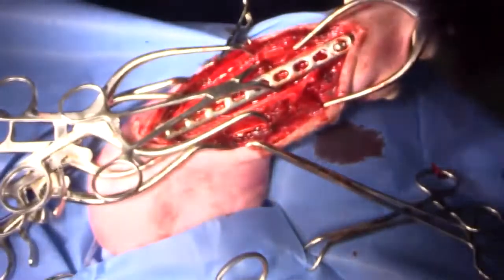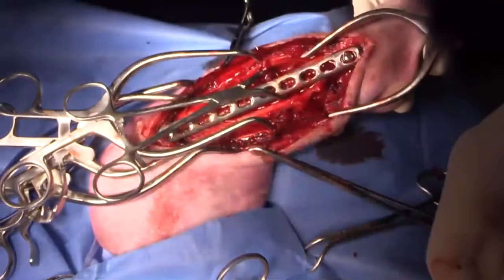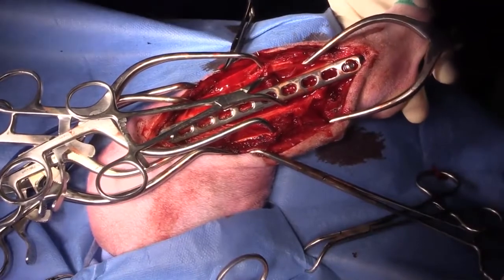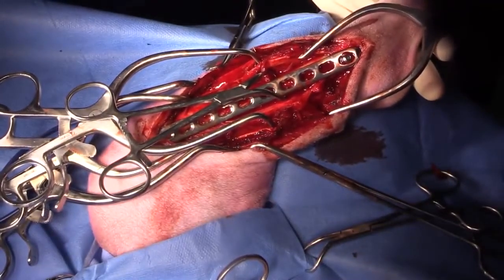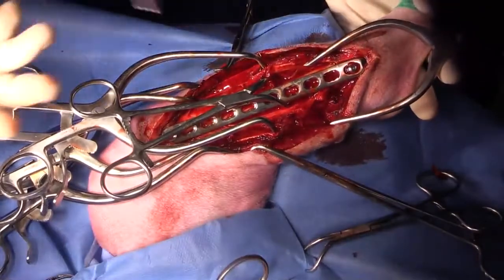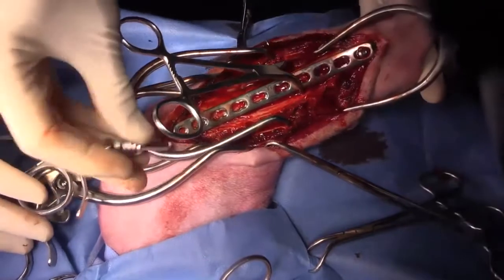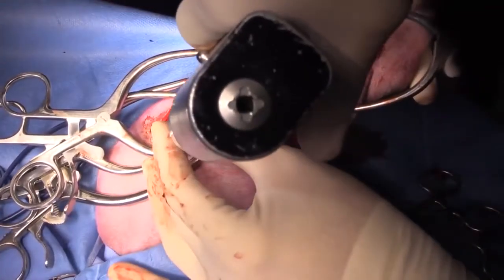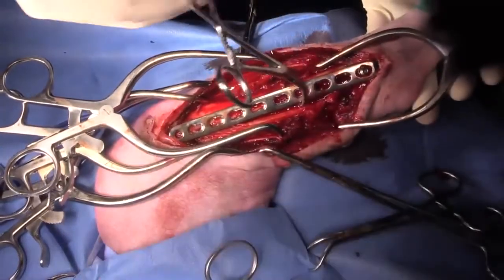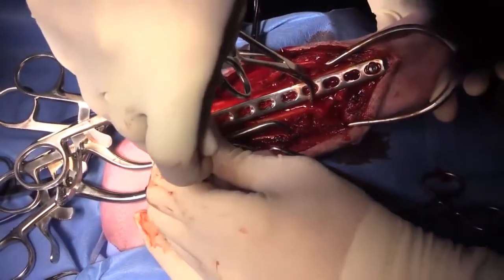Now I'm going to switch to a 2.8 millimeter drill bit for my locking screws. With distal or proximal fractures I tend to use a lot of cross pins, particularly if they're in younger dogs. That's the proximal tibial crest there — we're miles away from the joint. Very soft bone, so young. That's measuring 24, so I'll use a 28 again, but this is a locking screw.